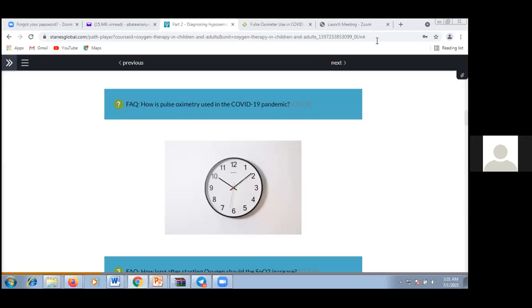We didn't have pulse oximetry, and now with this portable, easily accessible and relatively cheap pulse oximetry, we are using it in the emergency for triaging patients and for early recognition of hypoxia. We're using it at the OPD. We're using it at the normal wards for periodic checks. Like someone said, it's the other vital sign for managing any patient.